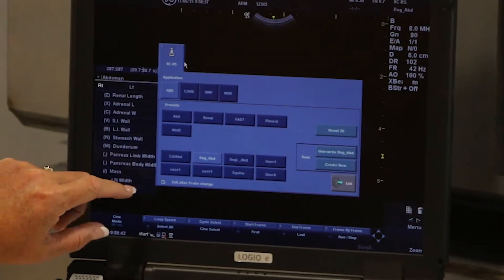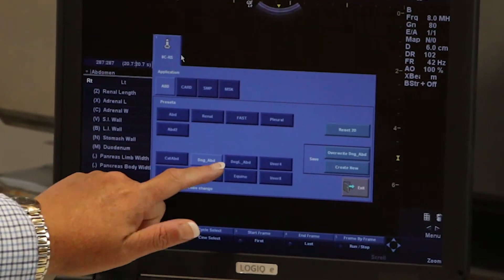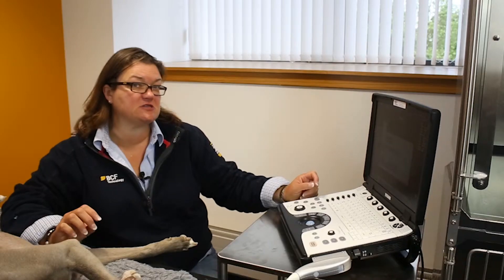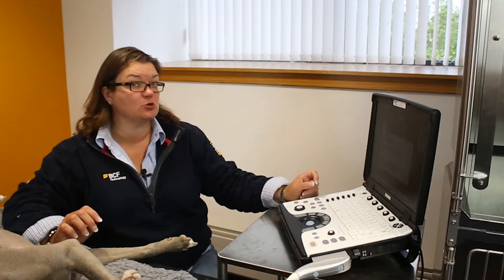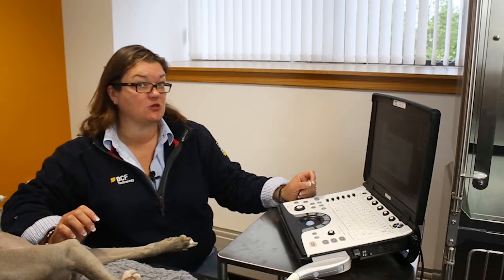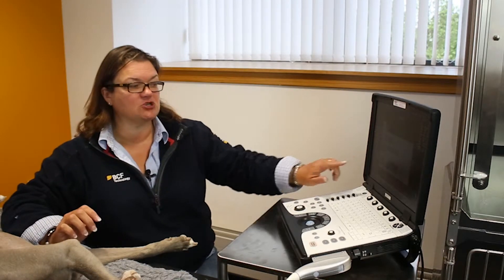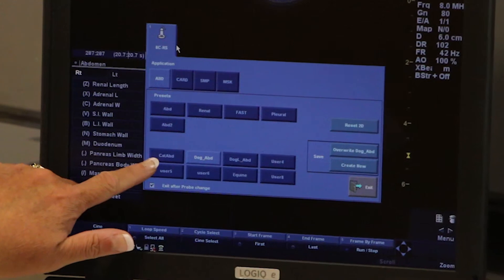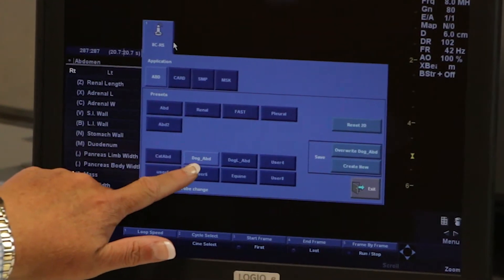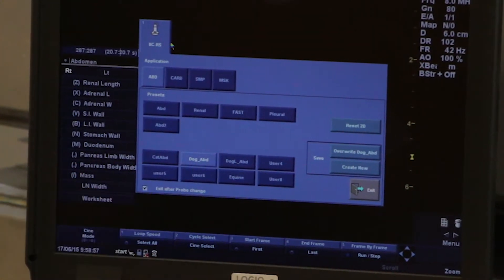At the bottom you'll have the veterinary specific presets that BCF will have programmed into your machine to get you started. On this machine we have cat abdomen, dog abdomen and large dog abdomen.